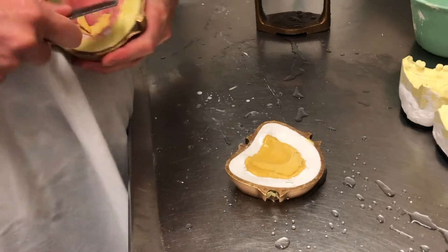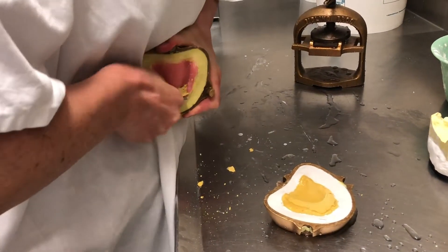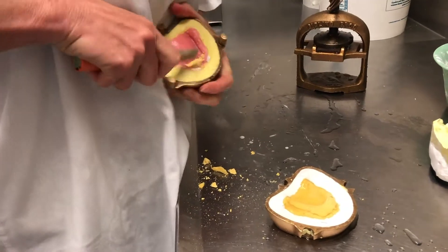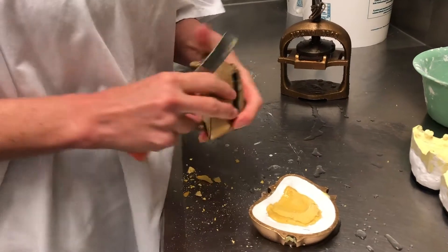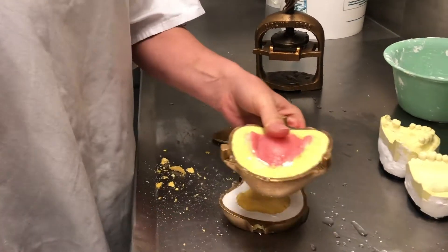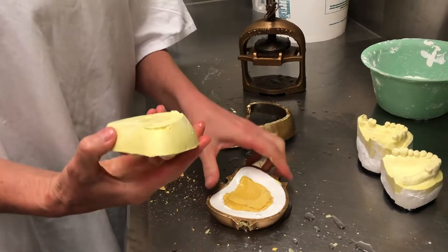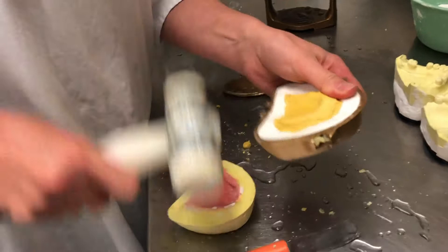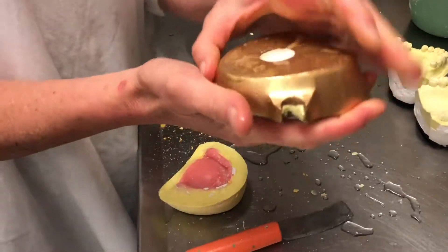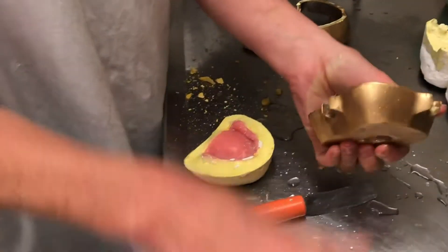And then I have to sit here and literally dig this out with my knife. If my knife was reasonably sharp, which is not too bad. So then we're going to get out of the flask. This was turning that wax denture into an acrylic denture. You'll get to watch the video, I'll put it in.